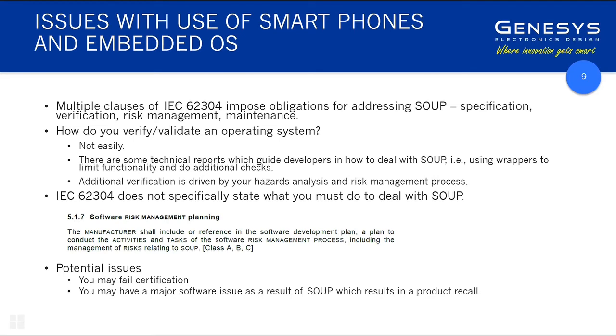Yep. George, given that some people use these SOUP-driven interfaces, is it a case that you need to have deep pockets, and that if you're a small startup or a small medium enterprise, it's just cheaper and easier? I don't quite get what you mean by not easily. I'm assuming, if you don't want to have to reboot your Windows system in the middle of an operation, and the hazards analysis says that if something like that did happen in the middle of an operation it would be catastrophic, then you just have to rule it out.